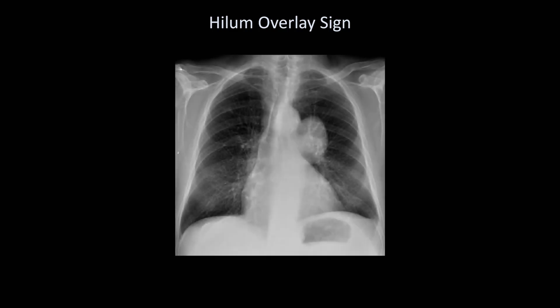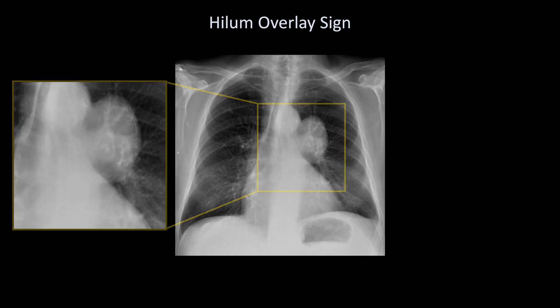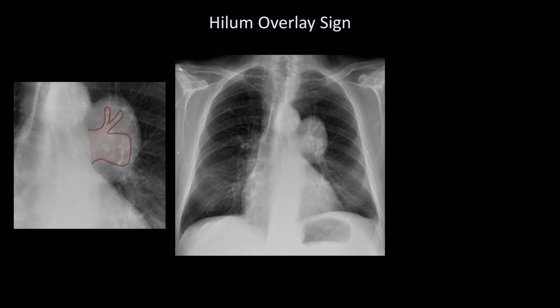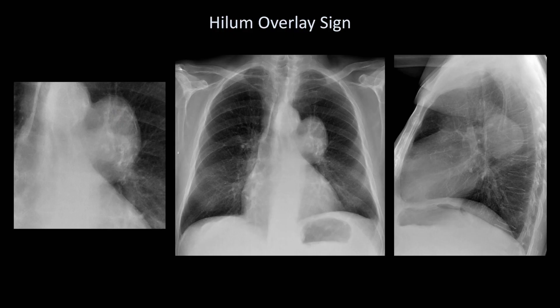I will end this lesson by talking about how one can use the hilum overlay sign to distinguish a hilar mass from one anterior or posterior to it. Consider this film, which has an obvious mass in the vicinity of the left hilum. When a mass arises from the hilum, the adjacent pulmonary vessels will become obscured. If the pulmonary vessels are still visible through the mass, the mass is not in the hilum. Zooming in, you can still see the outline of the left pulmonary artery. Checking the lateral film confirms that the mass is posterior to the hilum. To diagnose the cause, note a very thin rim of peripheral calcification, meaning either a vascular structure or a cyst — in this case, it was a saccular aortic aneurysm.